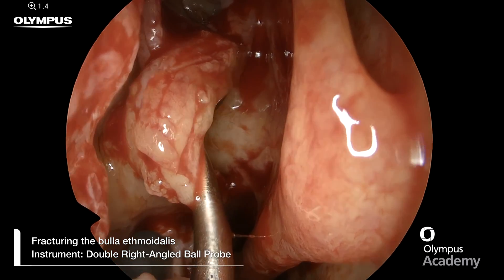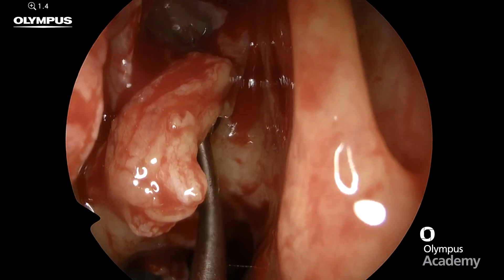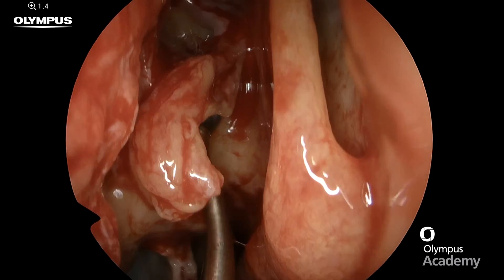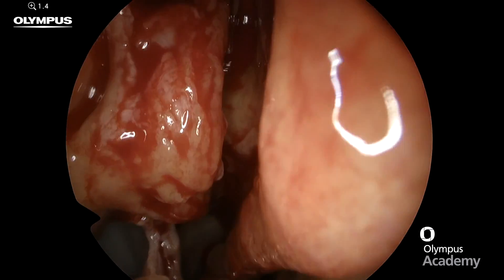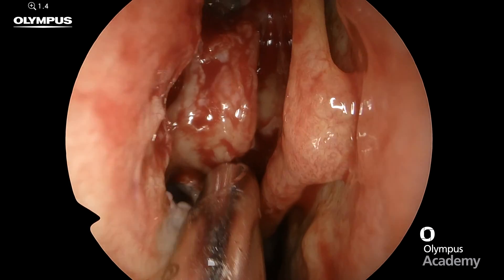The first thing to do is insert a double right angle ball probe into the natural ostium of the bulla, which is medial. Then pulling it forward, you can fracture the bulla anteriorly, as you can see here.